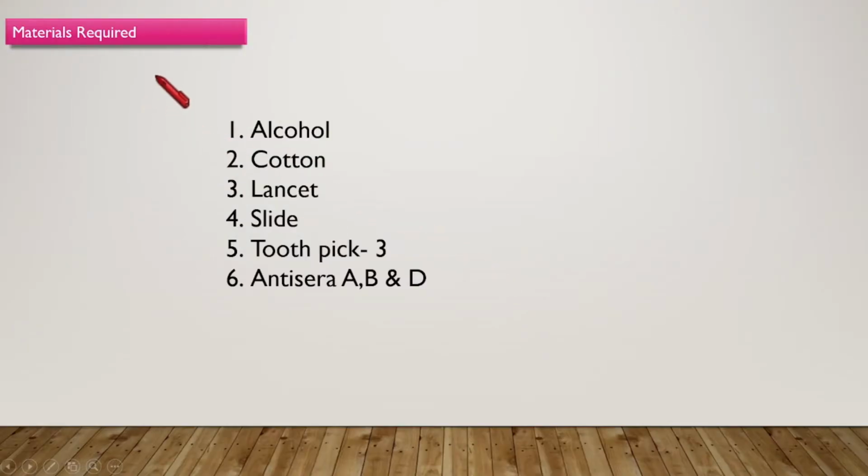Let's start the practical. For that we need alcohol, cotton, lancet, slide, three separate toothpicks to mix each drop of blood, then antisera A, B and D. All these things we require for doing this practical.